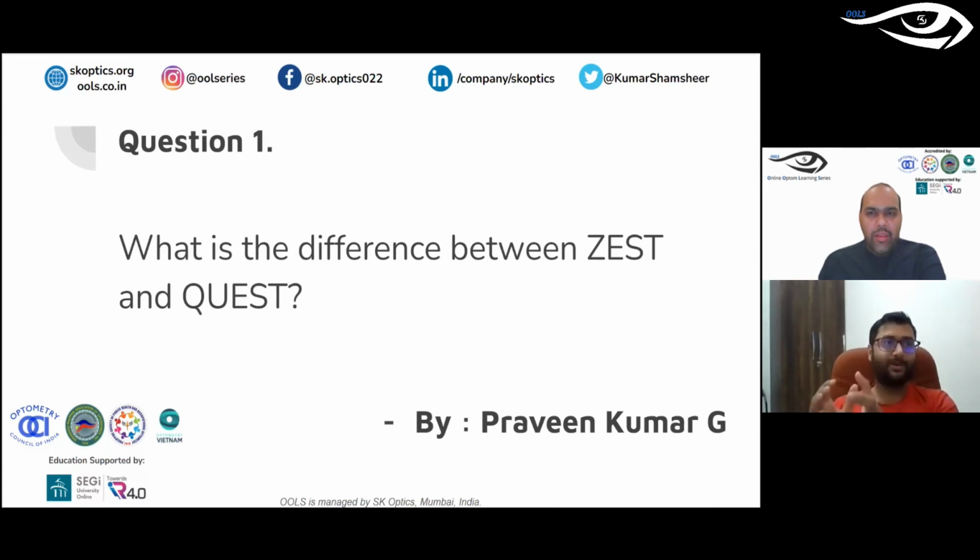And if you think the patient is not responding properly, please modify the instructions and ask them to do it again. Instead of waiting for the whole test to complete, redo the instructions, cancel the test, and then do it again.